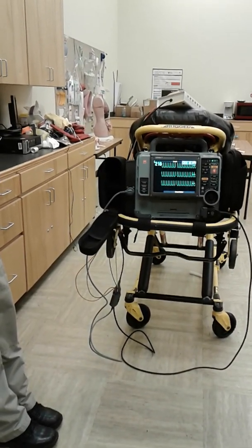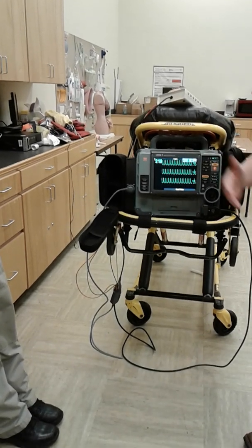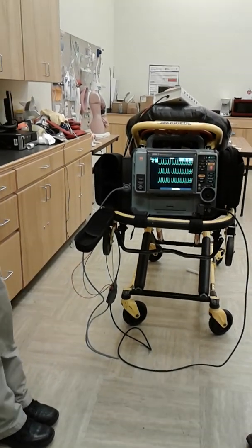Okay, so we're going to look in a second. We're going to call that SVT. How do I know that's SVT, not compared to AFib with RVR? Because it's regular. It's a regular rhythm, right?